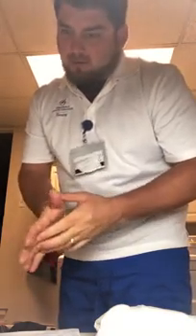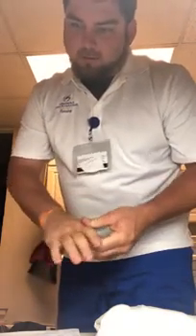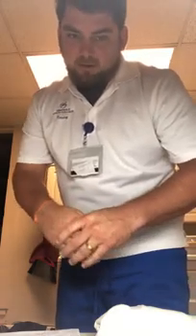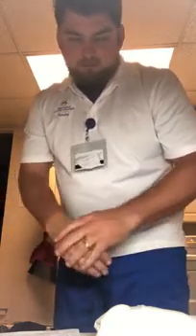She has orders here for 2 injections. We are going to be doing a B12 SubQ injection, and we're going to be doing a flu vaccine intramuscularly. Each injection is 0.5 milliliters, and we're going to go retrieve the meds, and we're going to double check the 6 rights while we're in here. So we've got patient and we've got the med here.